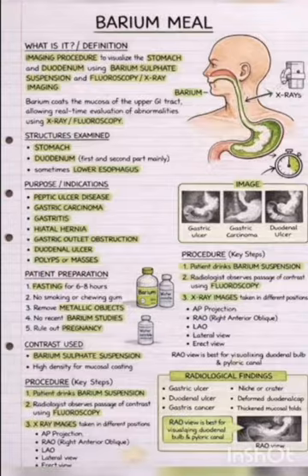For the evaluation of the fundus and duodenal fourth part, radiographs are taken in supine AP position. For determination of the hiatus hernia, the patient is placed in Trendelenburg position. Then, apply compression on the abdomen and radiographs are taken. For assessment of the duodenal bulb and retrogastric space, the patient is placed in right lateral position and radiograph is taken. For the evaluation of the greater and lesser curvature of the stomach, radiographs are taken in prone position with the central ray angled 30 degrees cephalic.